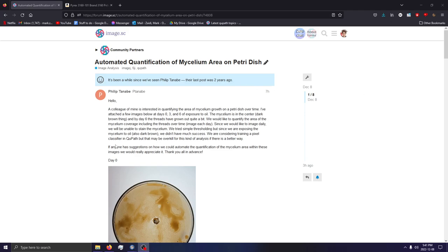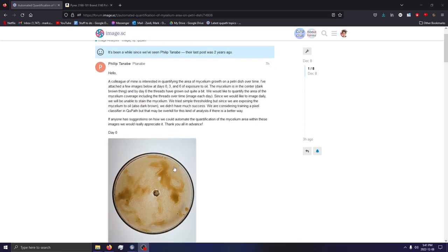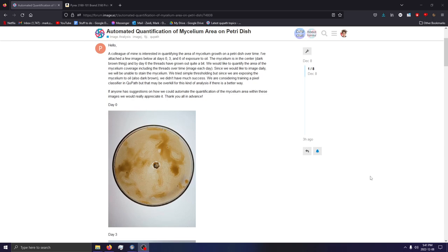I came across a rather interesting forum post about the automated quantification of mycelium area on a petri dish, so I figured I might make a video on this, given how niche and specialized it is. You don't really come across these kinds of posts on a forum geared for digital pathology, typically of whole slide images.